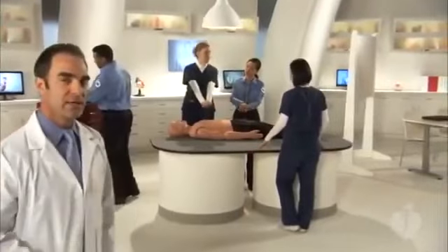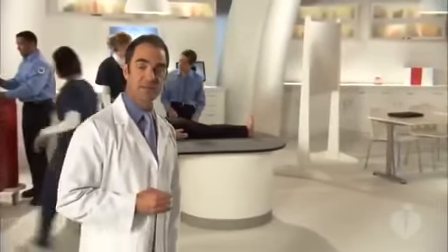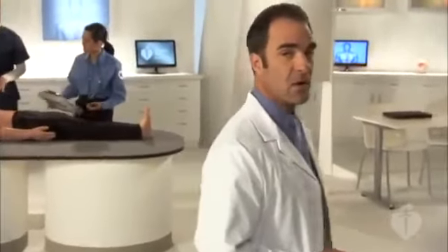We'll be demonstrating the latest life-saving interventions and the skills necessary to successfully manage arrest, peri-arrest, ACS, and stroke patients. Most of the instruction will take place here in the American Heart Association's training lab, where we can successfully demonstrate and practice those important skills. You, of course, will have the chance to practice skills in learning stations in your classroom.